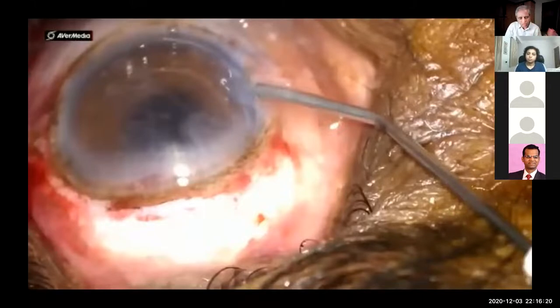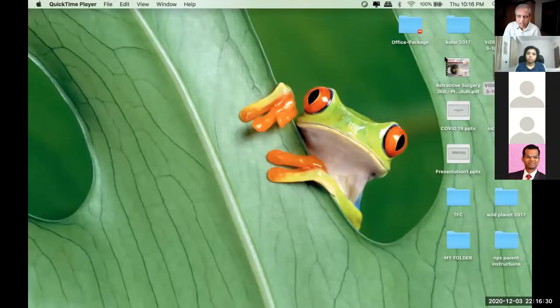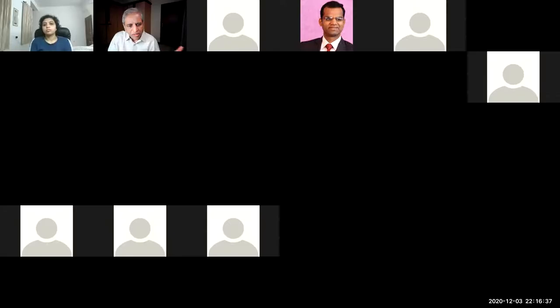The only thing is, you need to observe the endothelial count when you are changing technique. It gives very good feedback. And the other thing is, there is some calculation depending upon how much striate keratopathy you see on day one. You can roughly calculate; there's a formula, I've forgotten, I can't remember right now. If this much is striate, this much is endothelial loss.